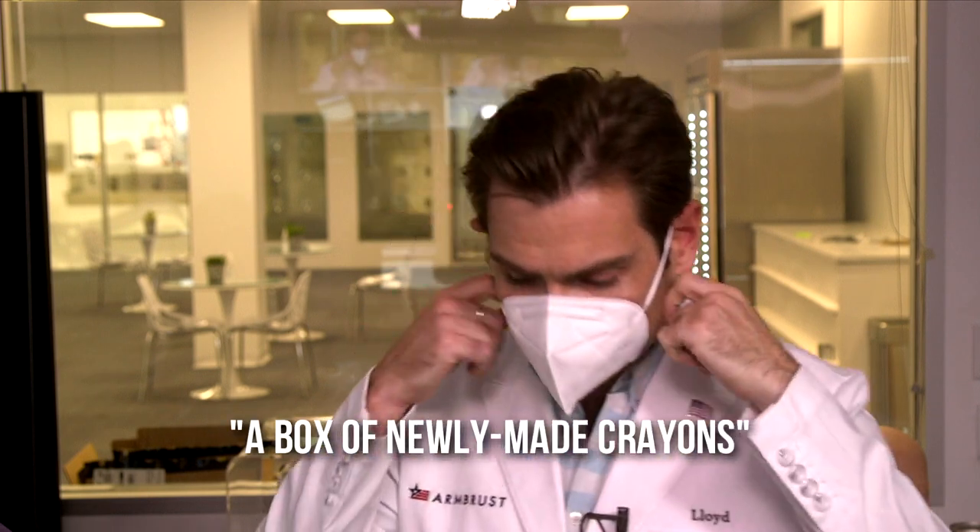This smells like — I'm gonna call this smell a box of newly made crayons. It actually kind of gave me a little bit of a headache. But does any of that matter if it doesn't protect you? Let's check out the machine — that's what you came for.